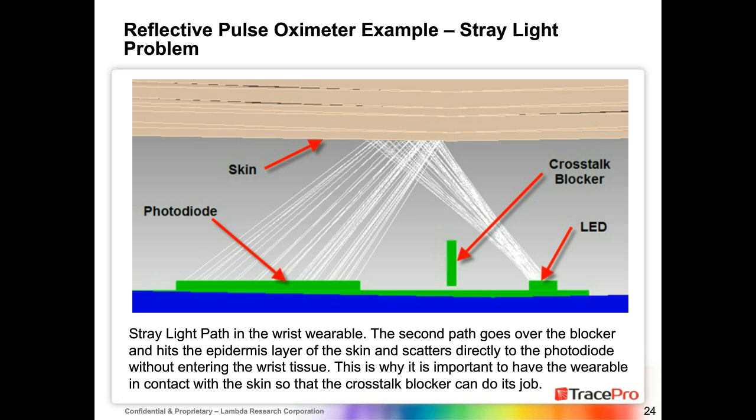Okay, and the last question. Can you summarize the simulation process to get scatter graphs? I assume 3D input, optical characteristics of detector and emitter, some sort of model for the scattering of light inside the flesh as a function of O2 content. Right, so you're going to specify using the Henyey-Greenstein function, a phase function that specifies how light scatters through the flesh in terms of O2 content.